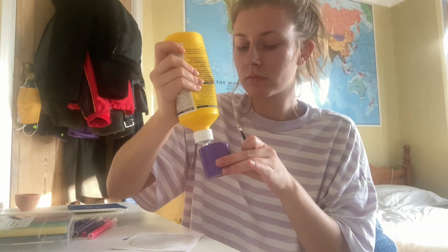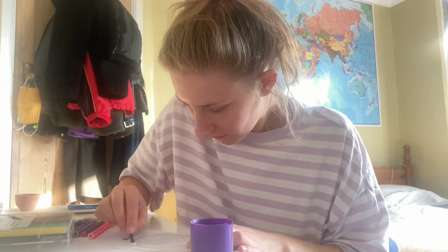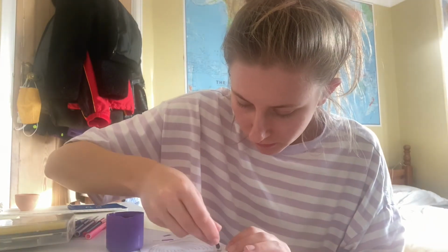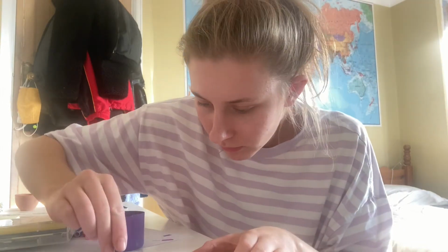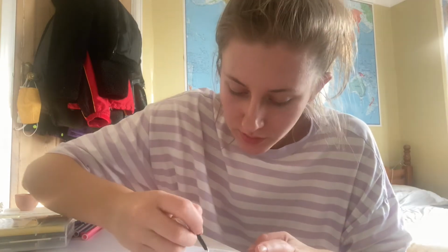So yeah, I'm just going to cover the whole of this in a light thin layer of PVA. So it's now fully covered with the PVA. It looks kind of lumpy and bumpy, and it does change the shape of the card, because it's almost getting it wet, so it does sort of lose its integrity. And that's why I did say you need a good card, so paper wouldn't have done, it would have gotten too wet with the glue.